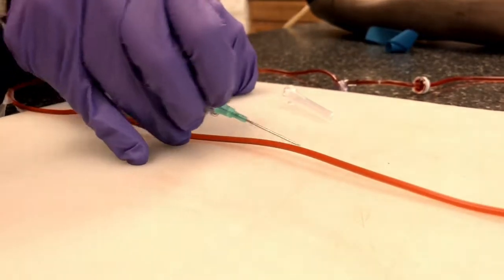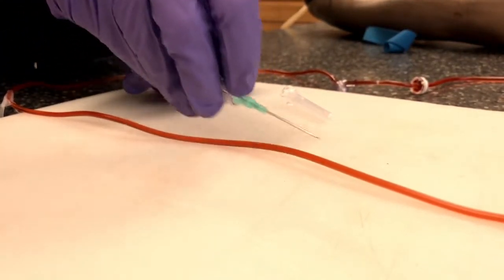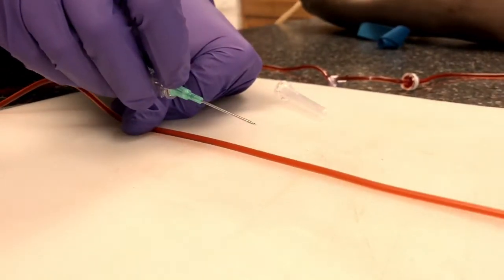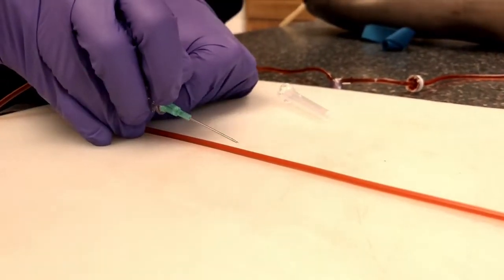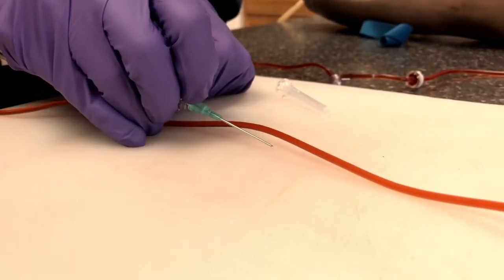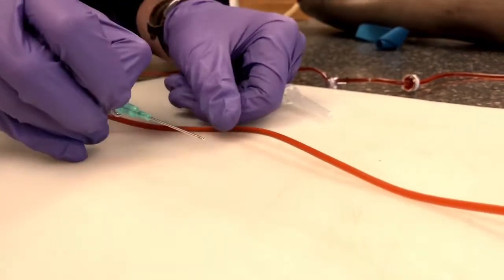The next one is traction. Obviously, getting into the vein is very, very difficult without traction. What we see very commonly is that people will pull traction, get ready, and they're right there, they're about to make the puncture, and they'll release the traction and the vein goes away. So watch out for that.